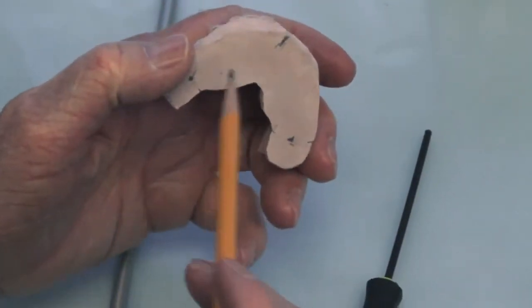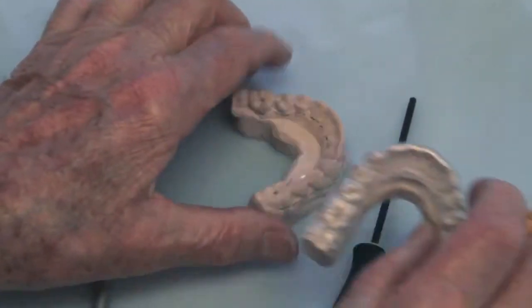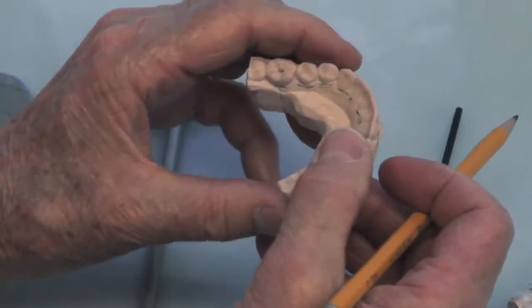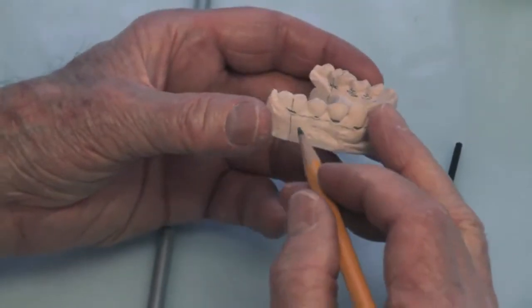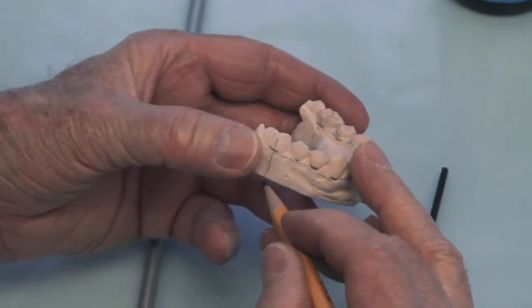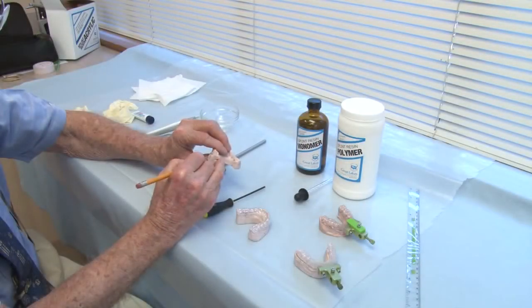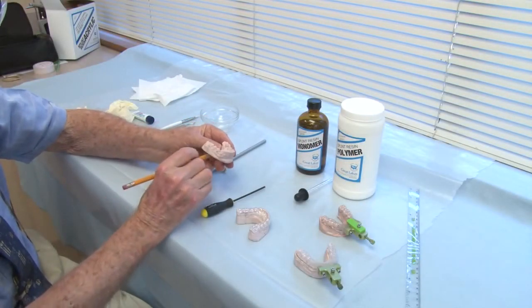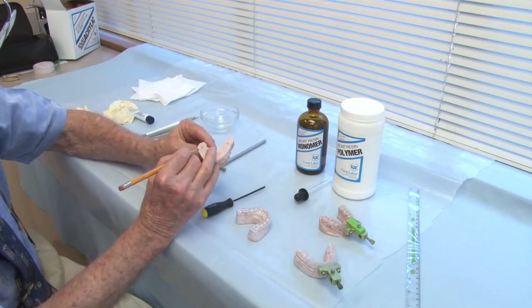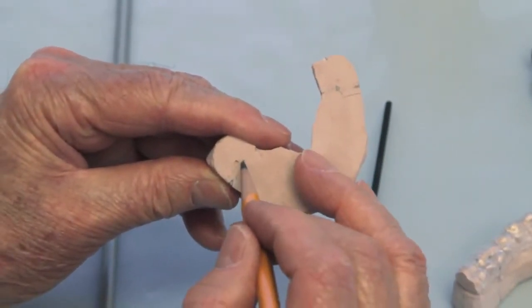And so when you make your clutch, you want it just a horseshoe shape of the lower teeth, not a base. And so to transfer and find that central fossa of the lower first molar, draw a line up with the central fossa, draw a line down to the base of the model on the buccal and the lingual on both sides. Then come over and locate those lines, and then you can measure and locate the central fossa of the lower first molar.